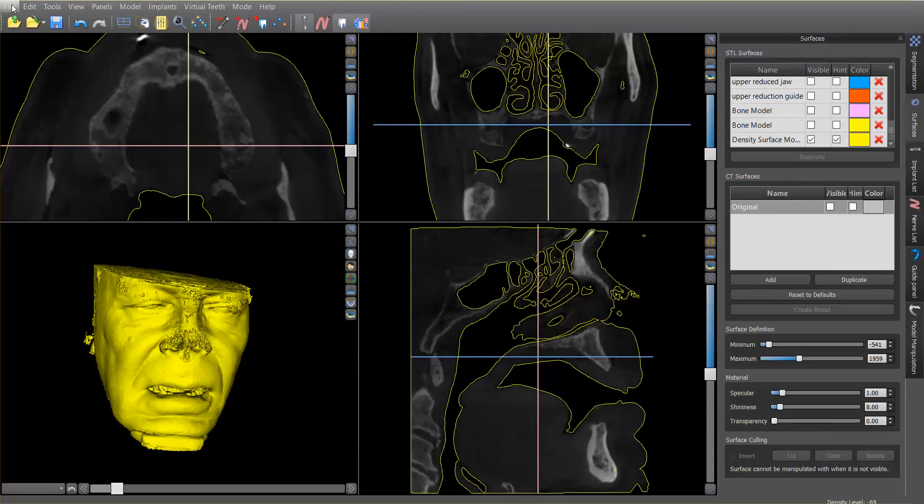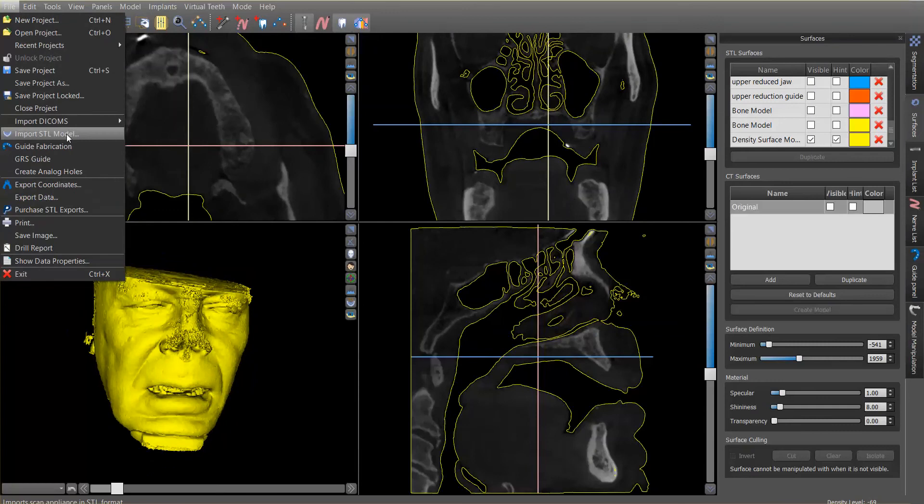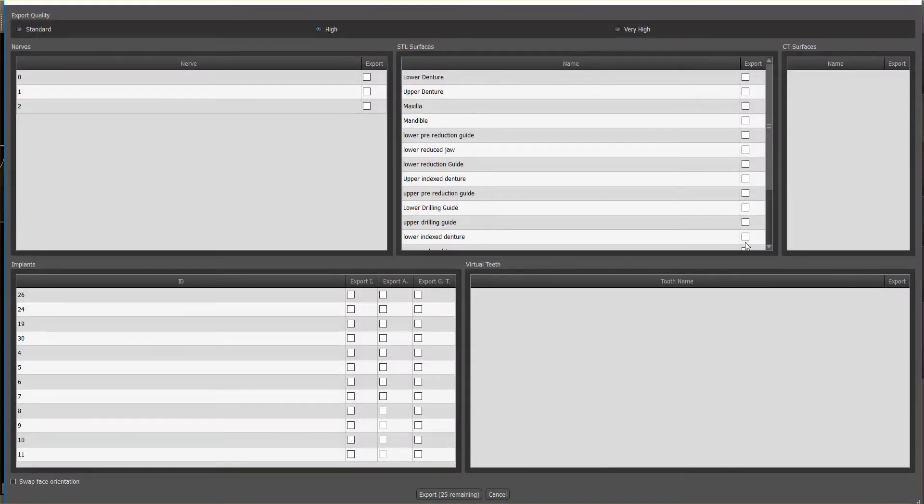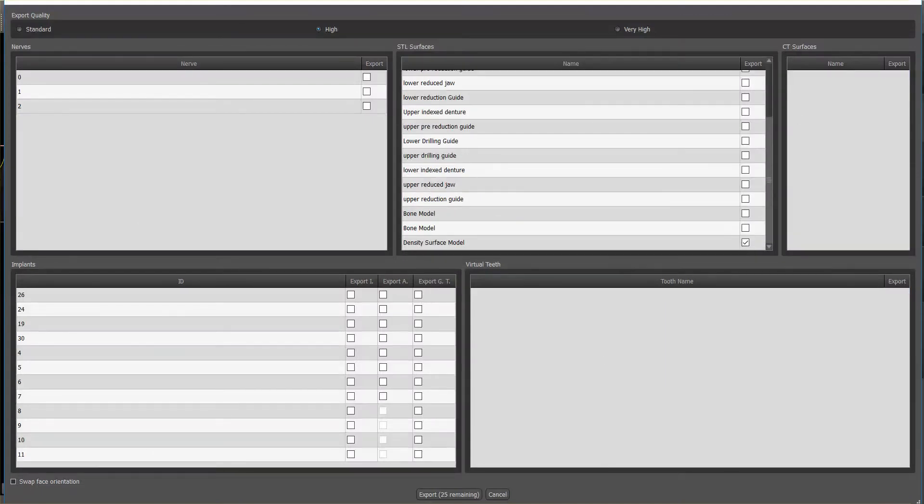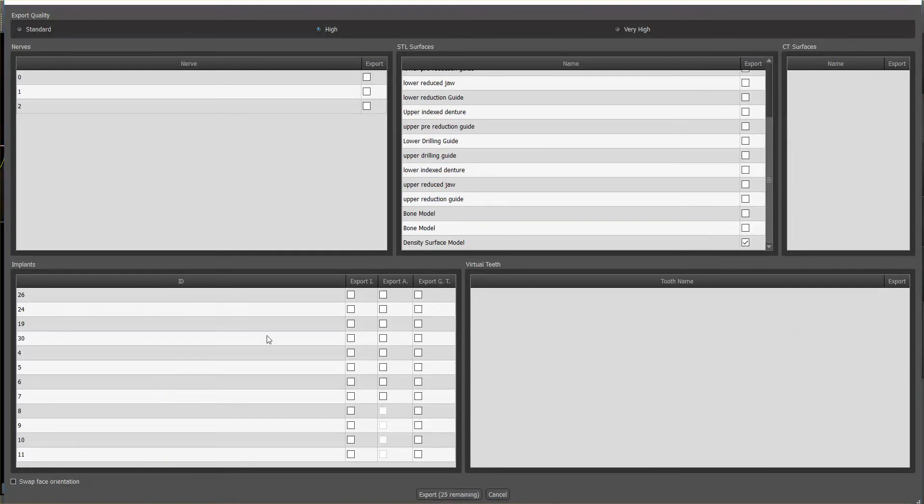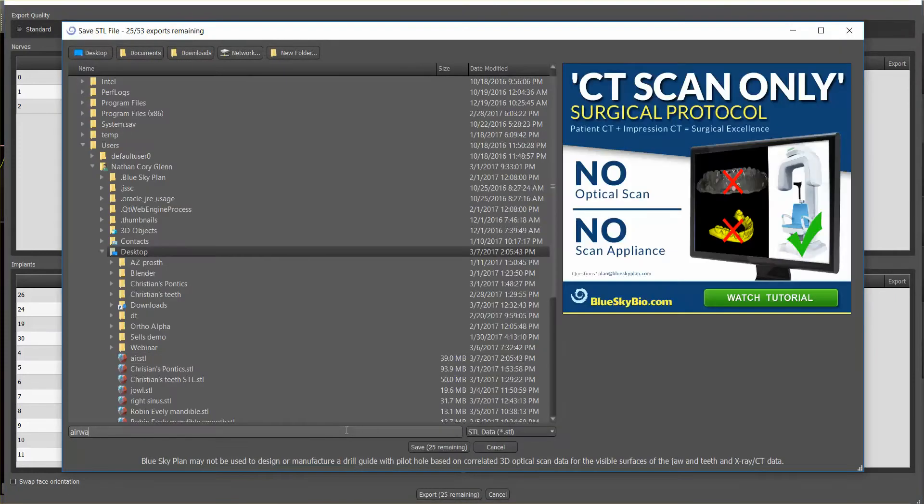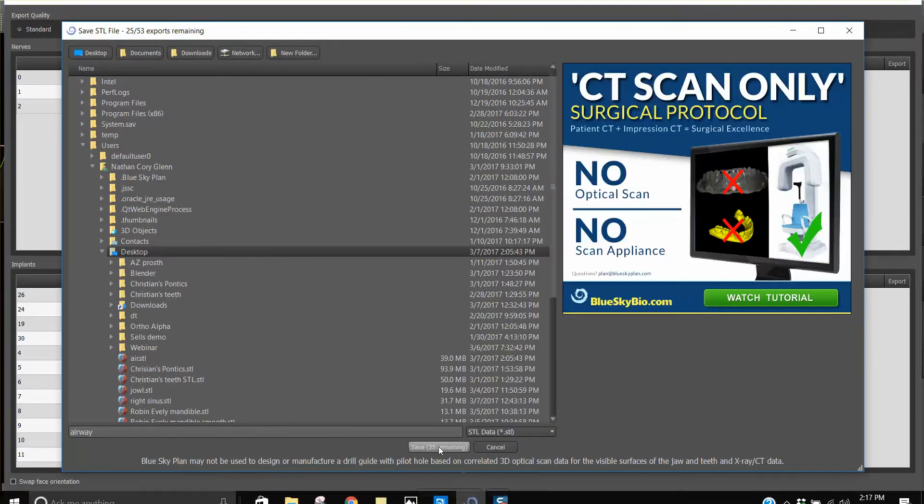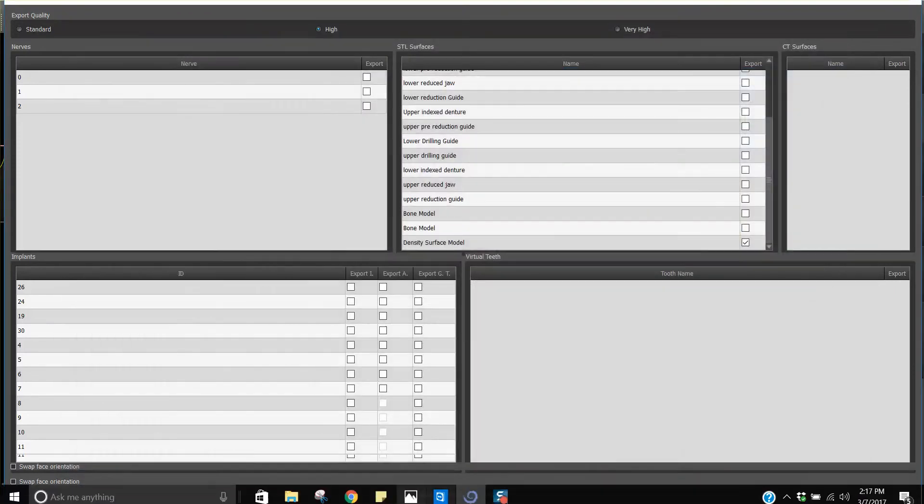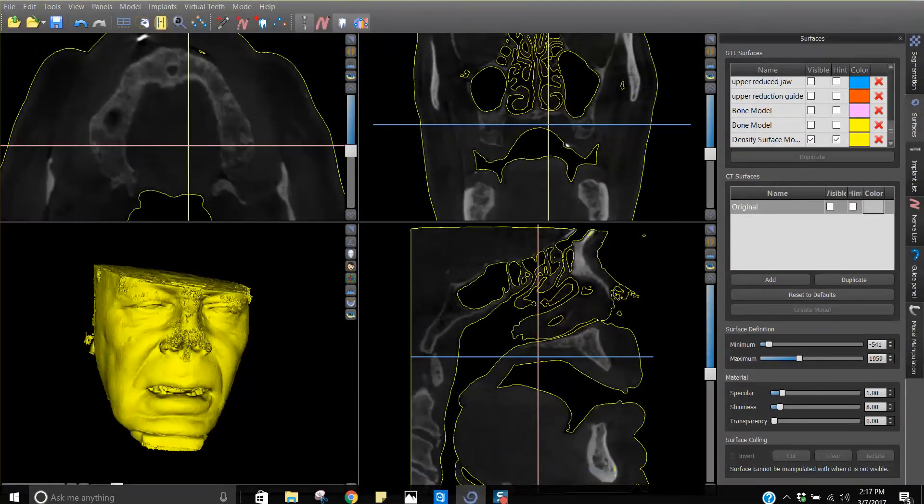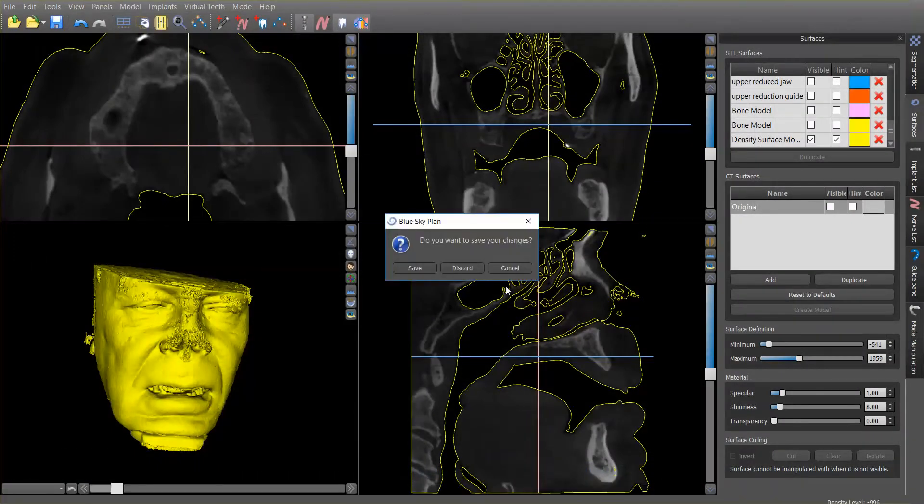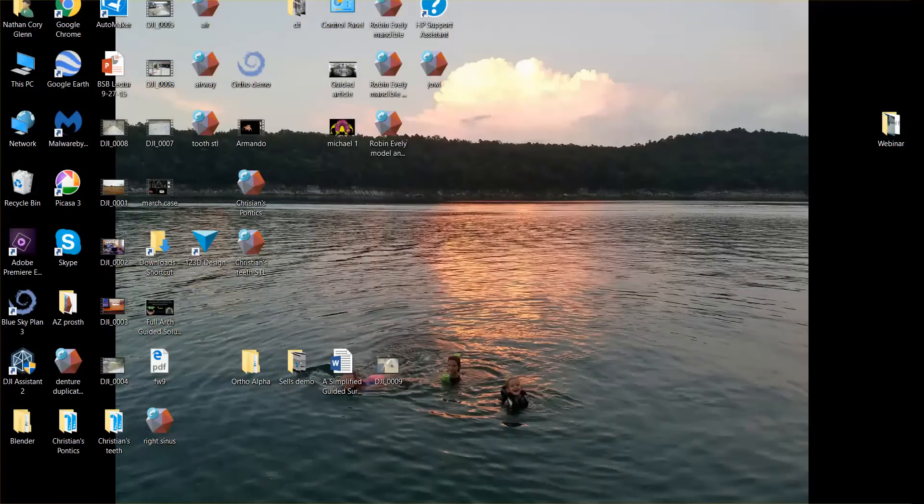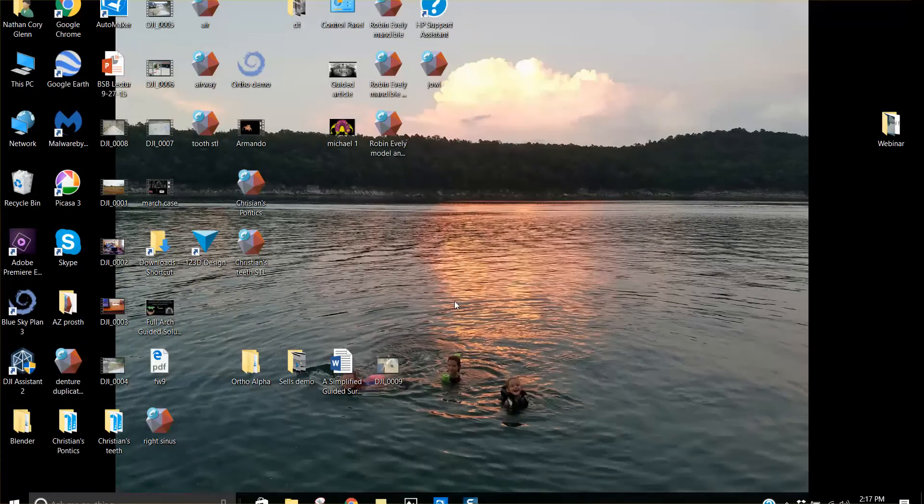Now I'm going to export this, because right now this model doesn't do us a whole lot of good. So I'm going to export data. I'm going to deselect everything except for that last little model that I created, airway. All right, so I'm going to get out of this case now, discard that, and let's open up this STL called airway.